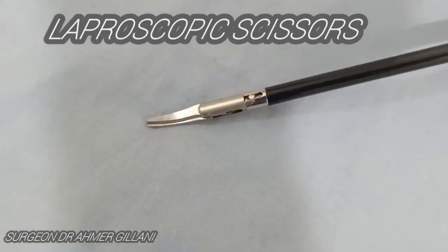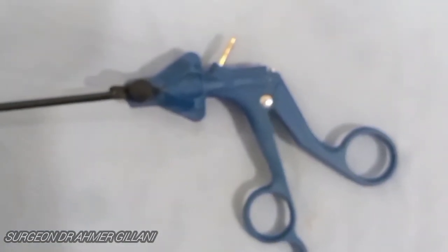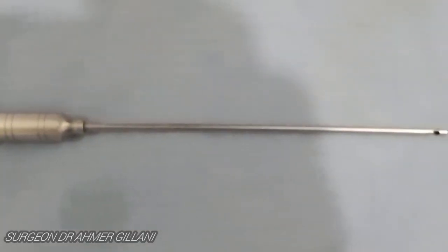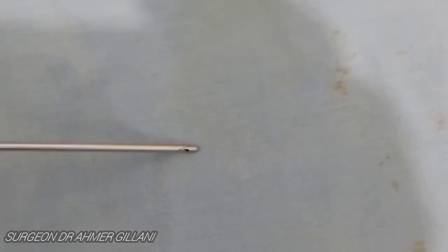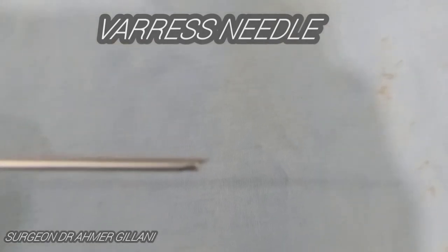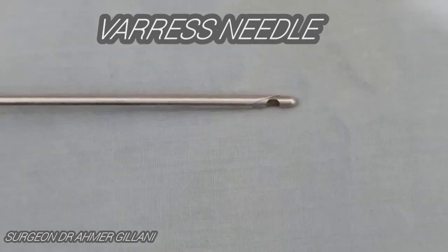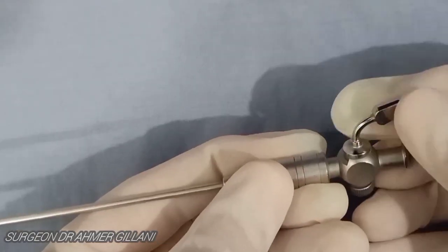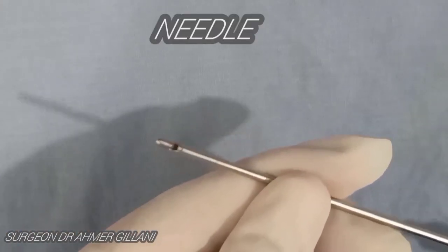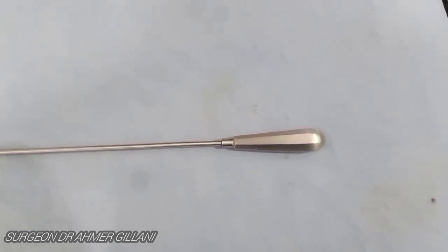Now you are seeing the laparoscopic scissor on your screen in close-up view. It is used to cut a variety of tissues including fibrotic or calcified tissues and sutures. The next instrument on screen is basically a spring-loaded Veress needle. When you press it on a hard surface, its blunt component goes backward, but when it comes in touch with soft tissue, its blunt part comes into action. In close-up view you can clearly see it is a spring-loaded instrument, which is very good for beginners.